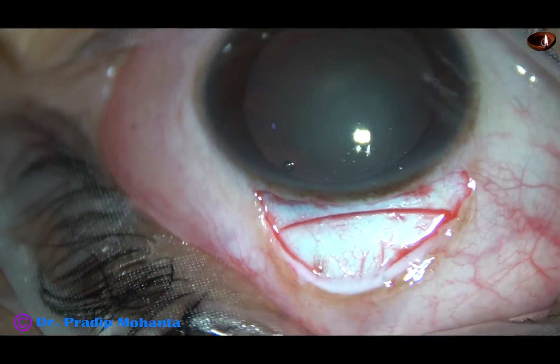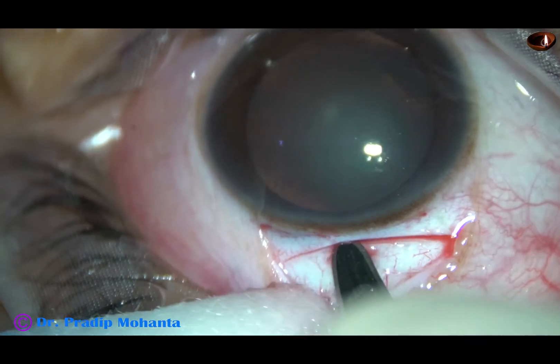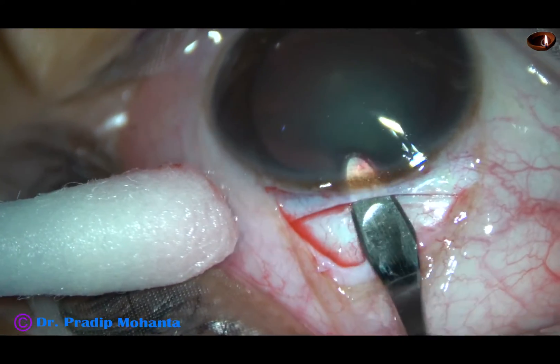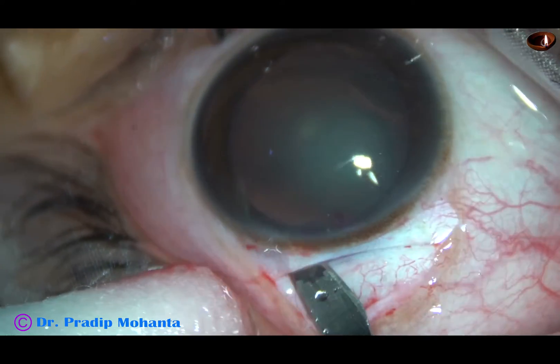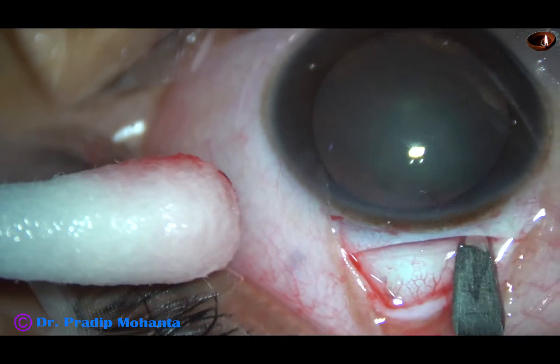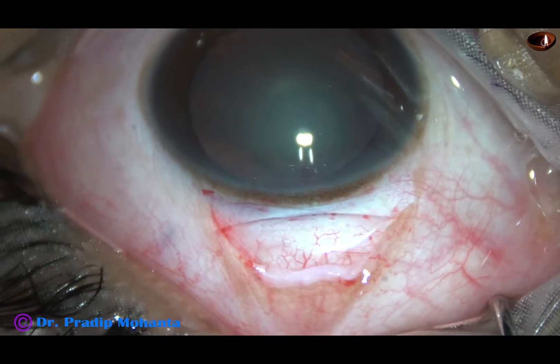This is about half thickness groove — a frown incision about 1.5 mm behind the limbus. Now I go to an appropriate depth of about half thickness of the sclera. I go forward at the central part and then sweep backward and to the left. So the tunnel on the left side from the center is made. And now I come to the center again and sweep backward and to the right, and thus I get a sclerocorneal tunnel of about 6 mm.